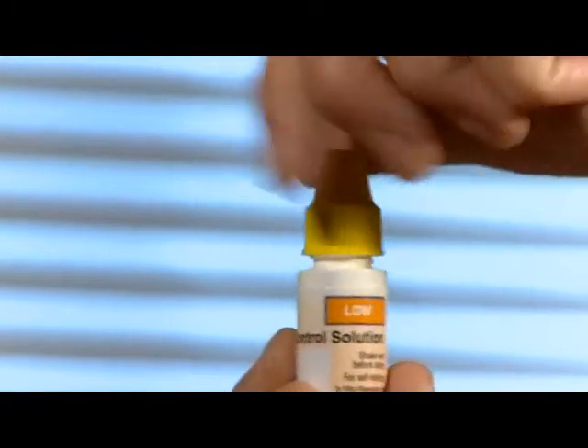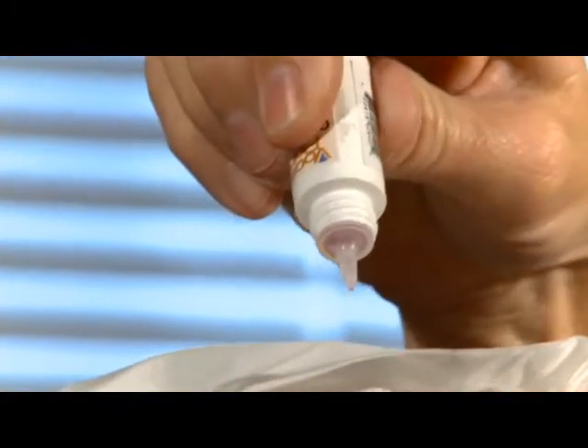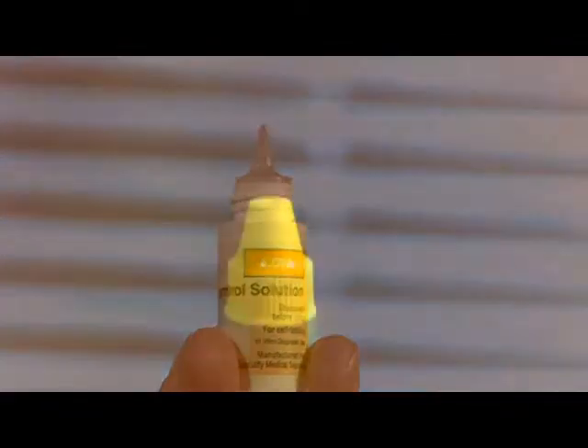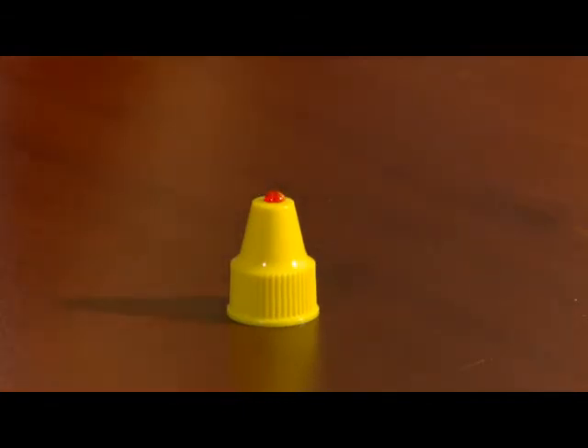Slightly mix up the solution by inverting it several times. Remove the top. Discard the first drop into a tissue and wipe the tip of the bottle off. Next, squeeze a drop of the control solution onto a clean, dry surface, such as the top of the control solution cap.